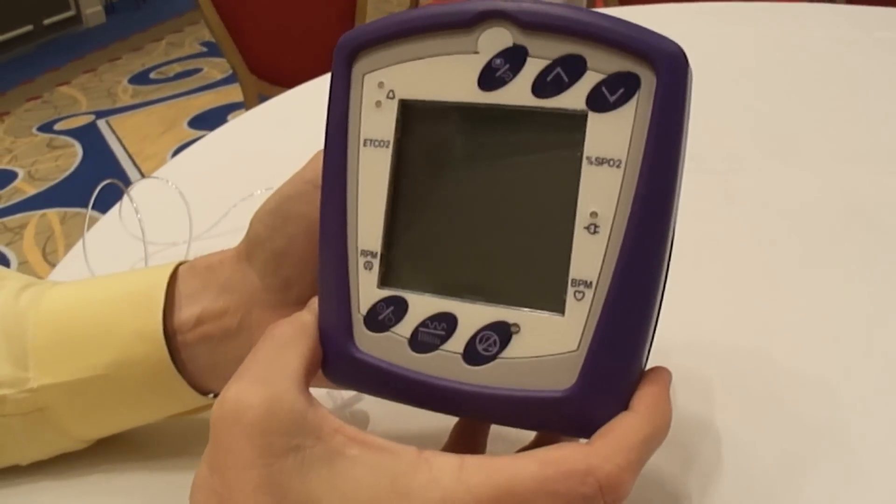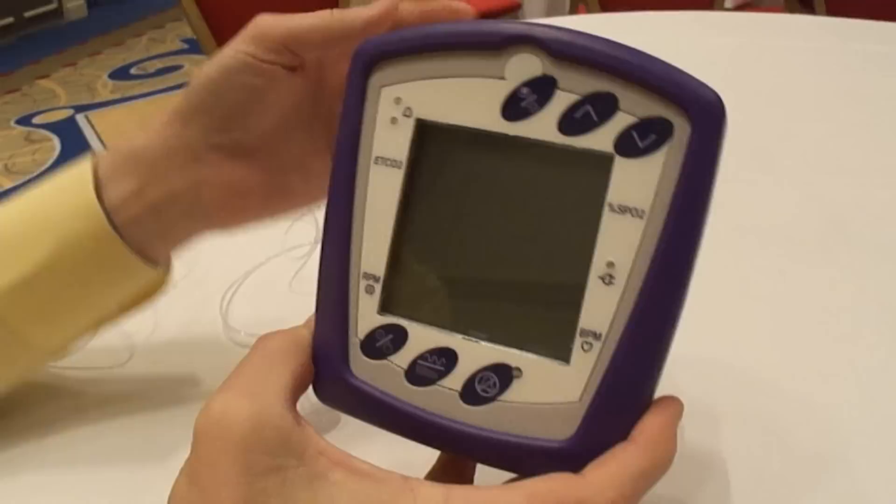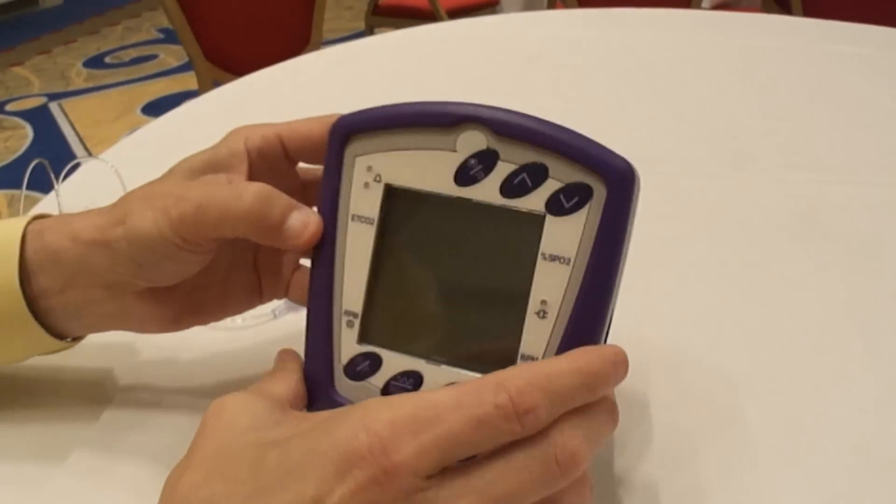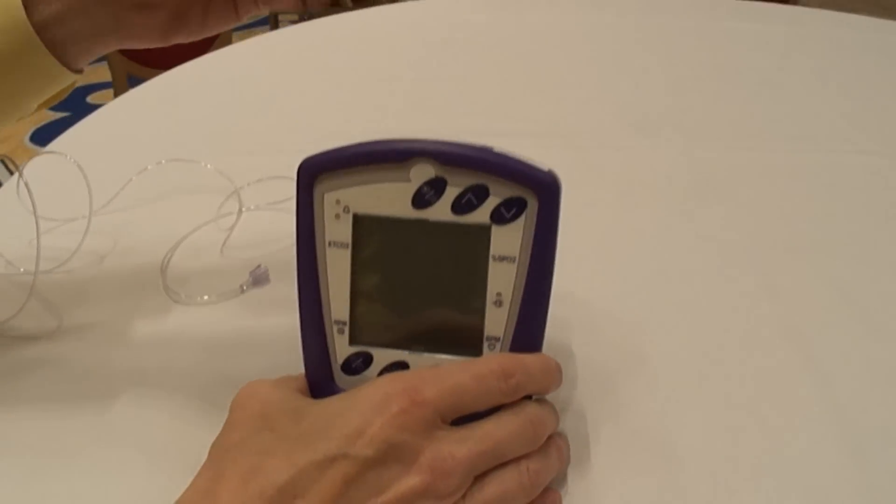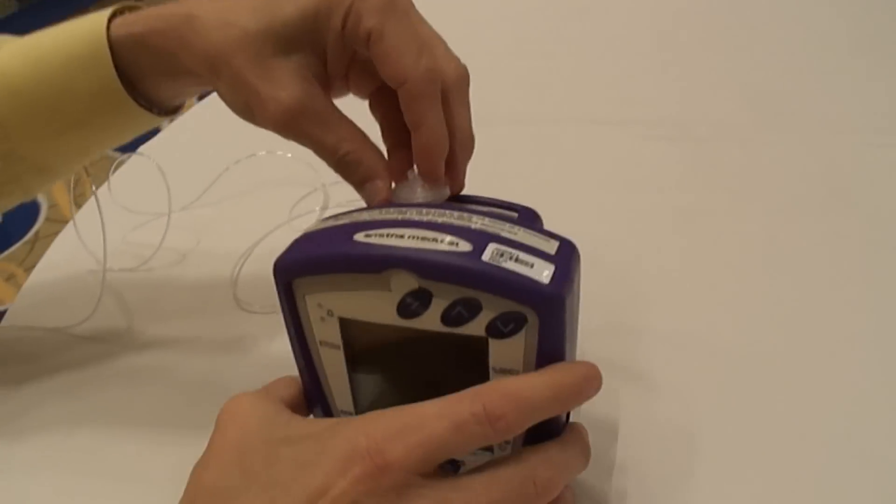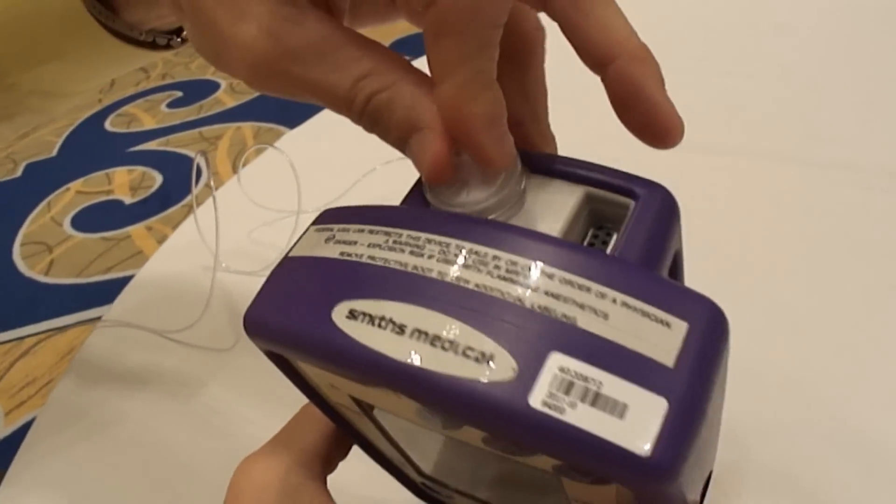You also get with it a battery and a battery charger. The way the unit works is it's for monitoring end-tidal CO2 and respirations per minute. First thing you have is a gas manifold that goes right here on the back. As you can see, it just slips in.